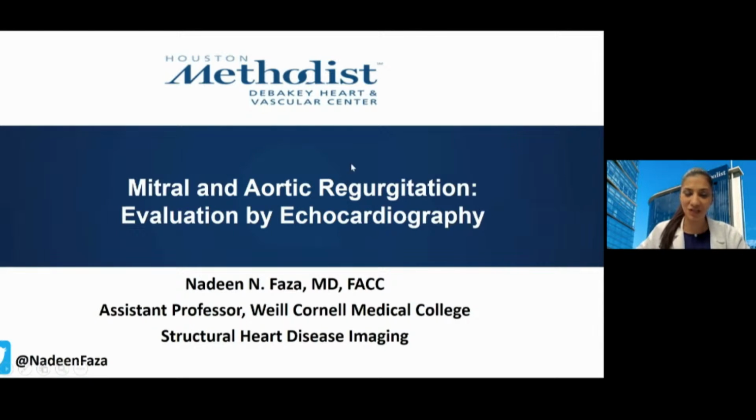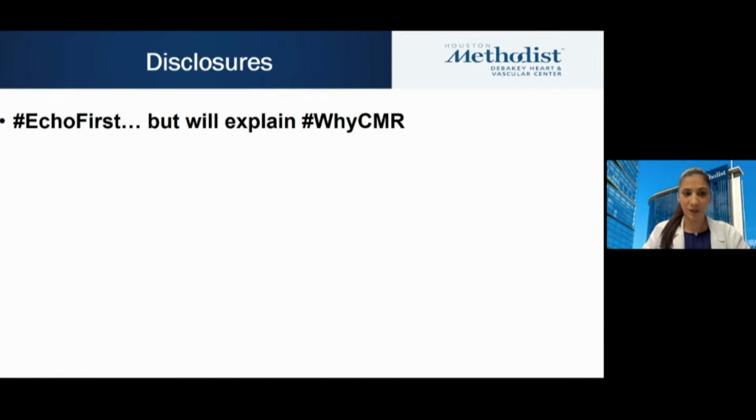I'm one of the interventional imagers here at Houston Methodist, and we'll be talking about mitral and aortic valve regurgitation by echo. We're going to be talking about echo first, but I'll make sure to explain why CMR is also very useful in the evaluation.